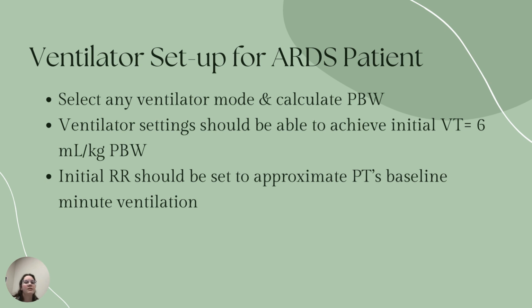So your vent setup for an ARDS patient, it doesn't matter what mode you put them in, whatever works best for them, whatever they're most comfortable on and keeps their numbers where we want them. But you are going to want to calculate their predicted body weight. This is important for their tidal volume settings.